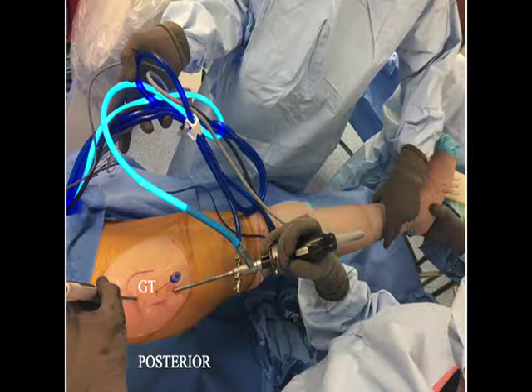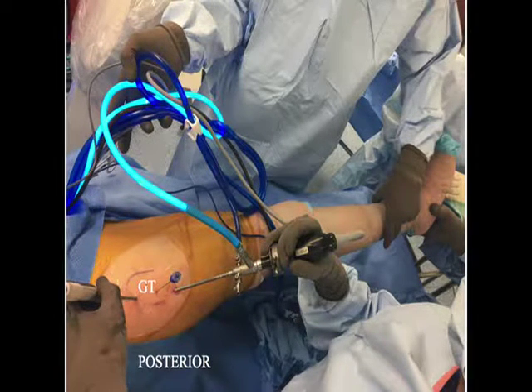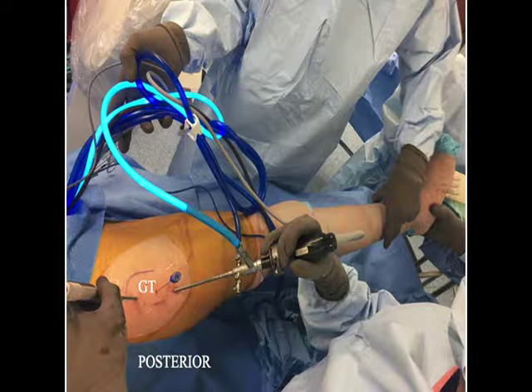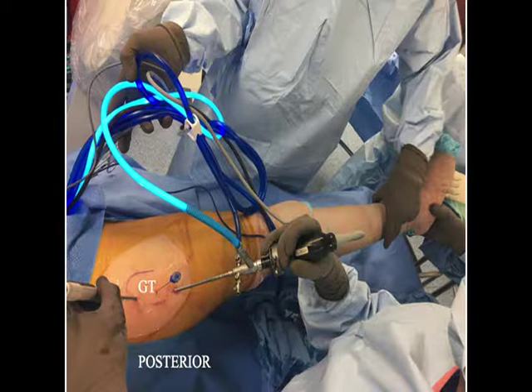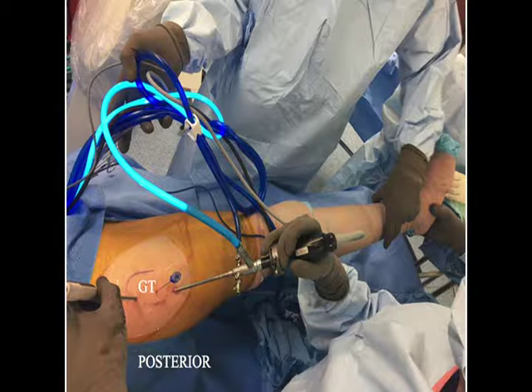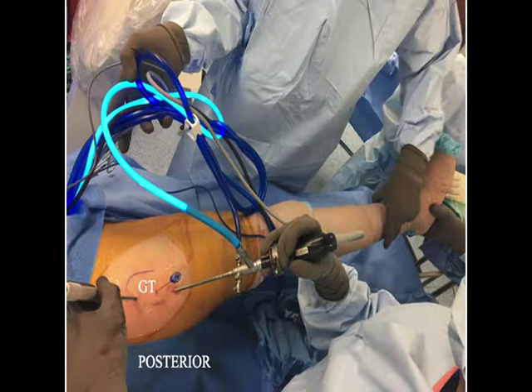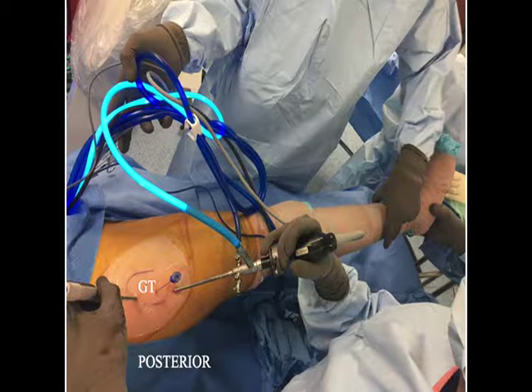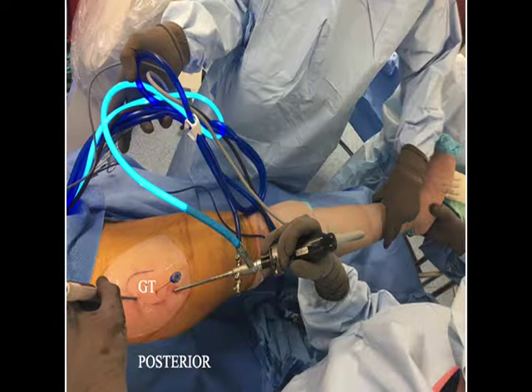We position the patient in the lateral decubitus. In this case, the right side is operated. Note the leg is drape-free to facilitate mobility. A spinal needle is in position on the lateral aspect of the greater trochanter, and instruments are in position in the proximal and distal trochanteric portals.